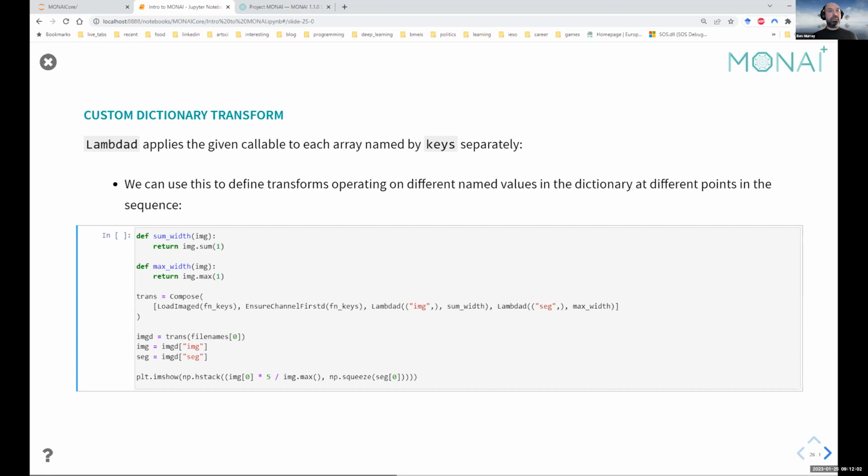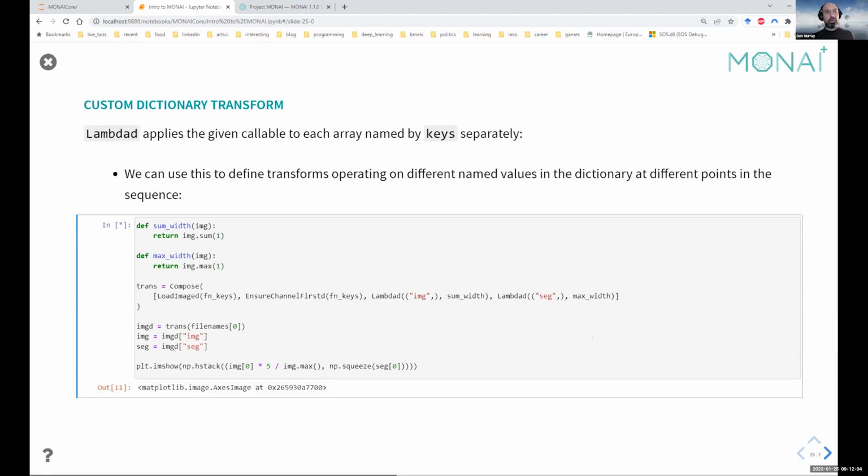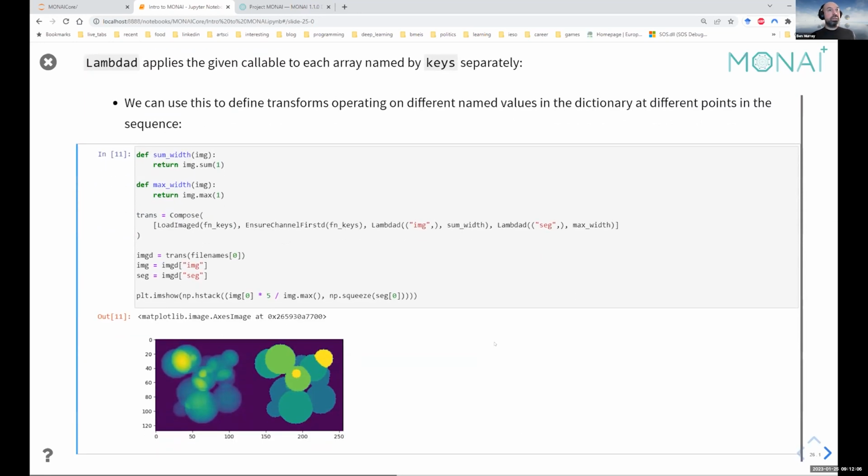as you can see. And I'll just run this very quickly. You'll see we've got this summation activity going on the actual data, but the segmentations don't sum. Basically, one value wins out. The largest value wins out.